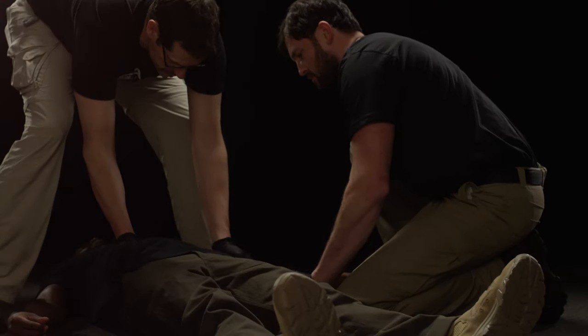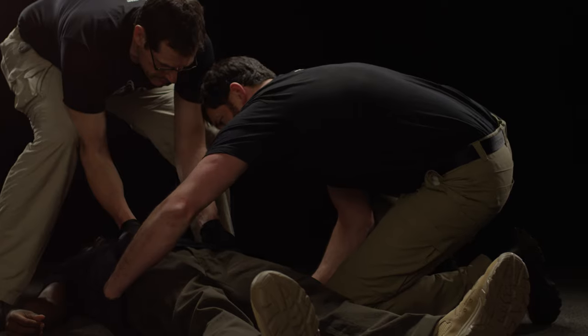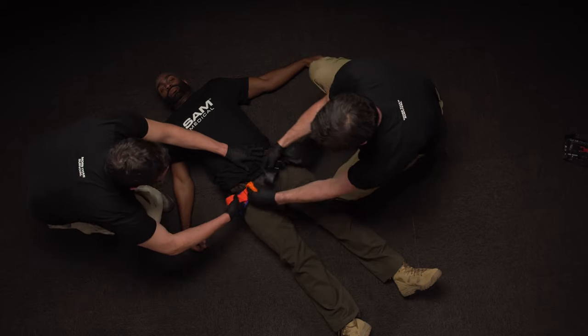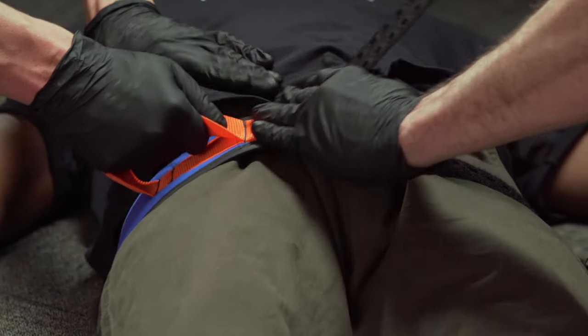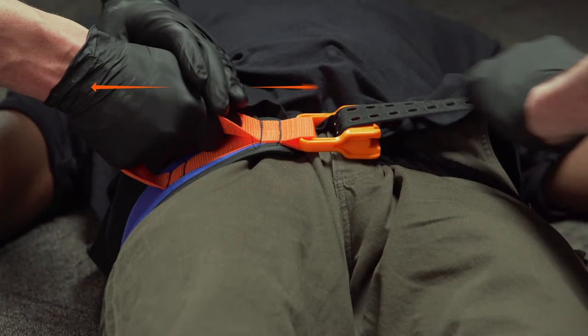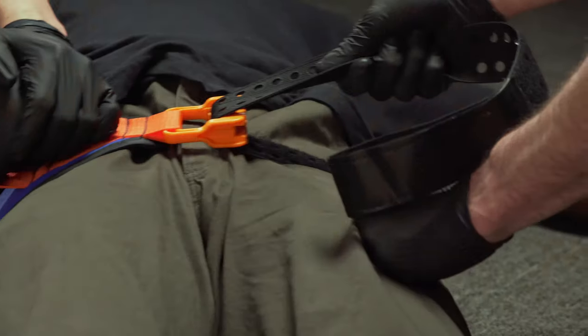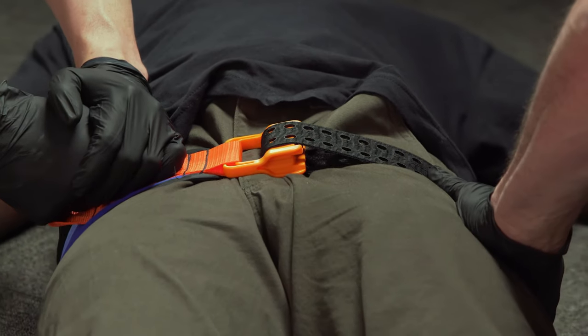Place SAM Pelvic Sling beneath the patient by gently lifting them and slide SAM Pelvic Sling under the patient's pelvis. Feed the Black Precision Strap completely through the buckle. Then pull the orange handle while pulling the Black Precision Strap in the opposite direction. Pull until you hear and feel the click of the auto-stop buckle.